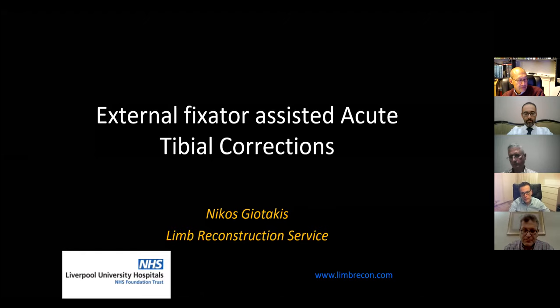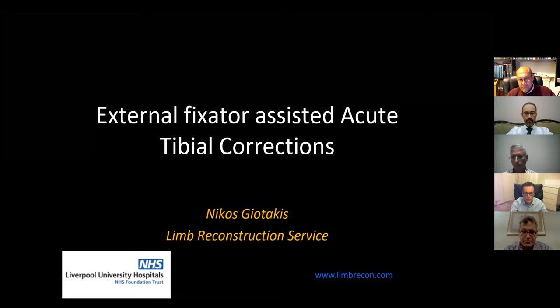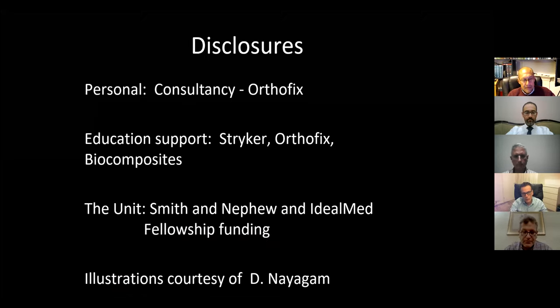So what really is the motivation on using acute corrections? Well, although the results can be quite predictable and successful with external fixation, we're all aware of the burden to patients, the length of treatment, and therefore there is a drive on trying to improve the quality of care and the experience for patients as much as possible. So we have been using, as I mentioned earlier, this technique for a number of years, and I will proceed to show you the method.